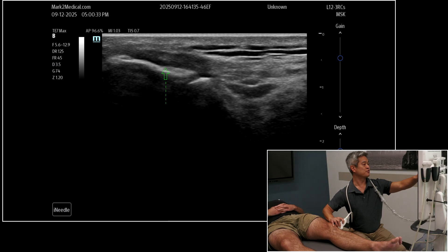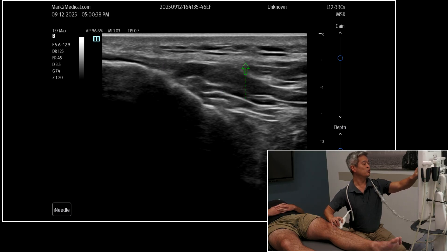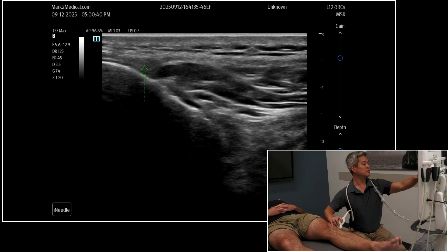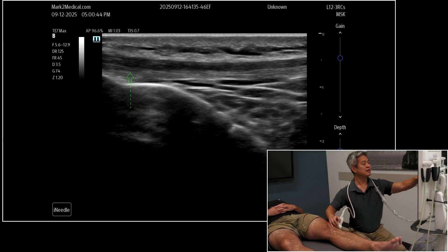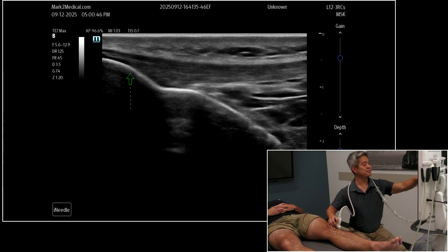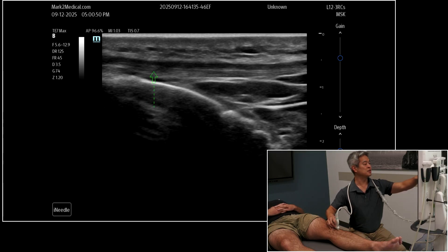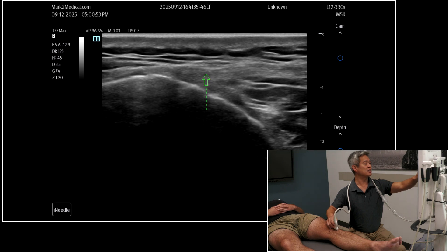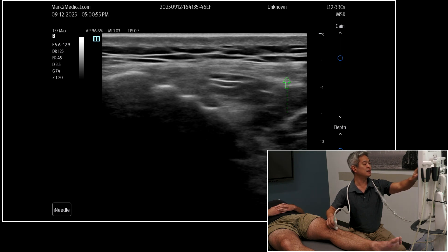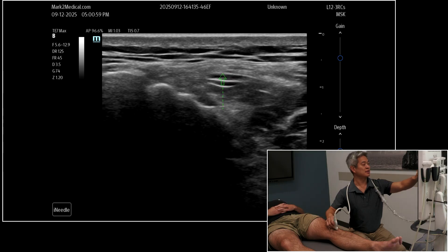Going in reverse from lateral to medial: you have the iliotibial band and Gerdy's tubercle, then sliding medially you get the wispy lateral retinaculum, then continuing medially back onto the patellar tendon. Now going in the opposite direction — sweeping medially through the patellar tendon — the patellar tendon disappears and you get this wispy hyperechoic band again, which is the medial patellar retinaculum.